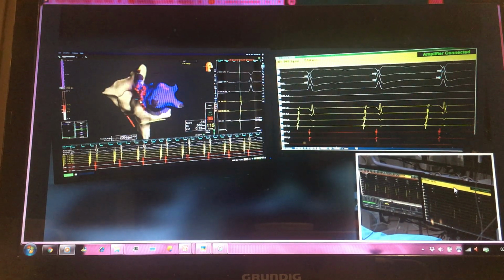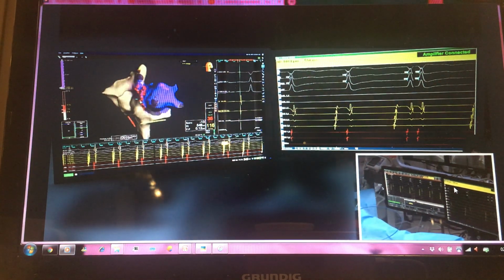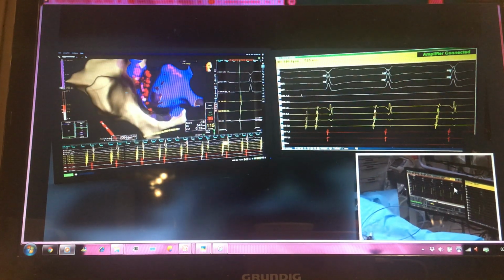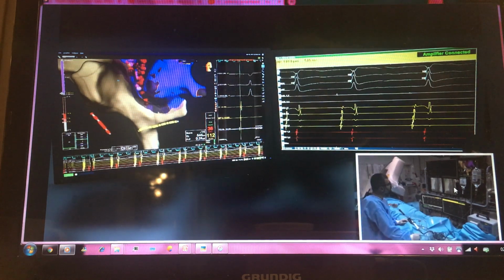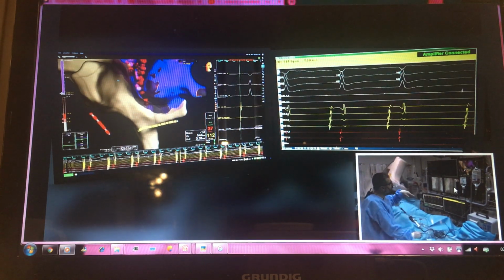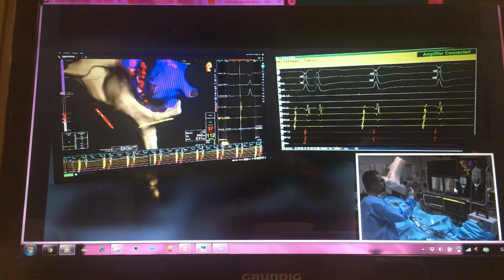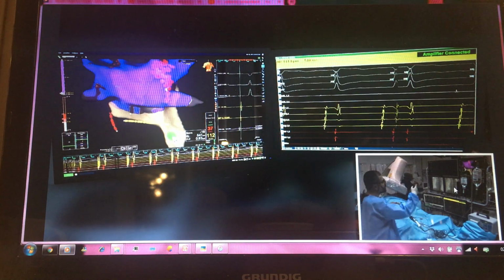If heart rate increases more than 20%, it demonstrates your cardioneuroablation may not be effective. But there is no consensus for the level of atropine response.